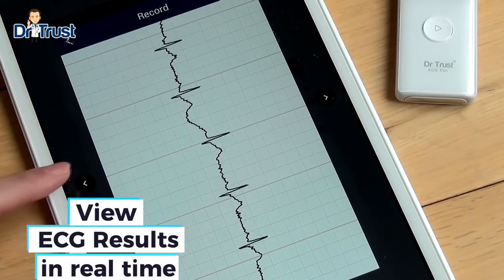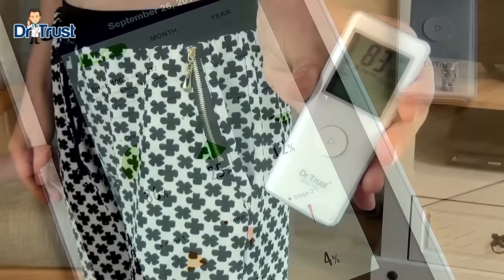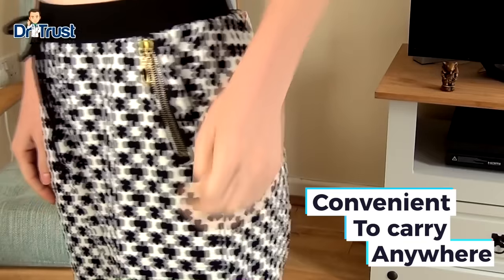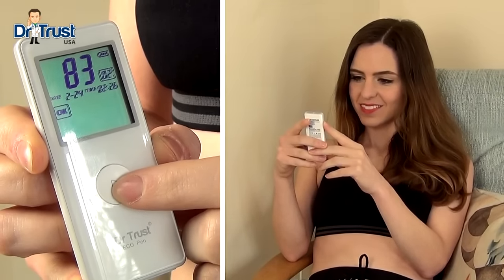You can view your ECG in real time while the measurement is taking place and review your heart trace and results by checking the records feature. Portable and lightweight, the Dr. Trust ECG Pen weighs only 30 grams and fits into any pocket. Stay in the know with your health and get your Dr. Trust Smart Portable ECG Pen today.